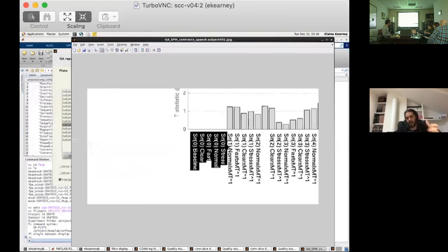And that's why it's telling you that the individual effect sizes are not estimable, but the contrasts that you are then looking at are estimable, because you're always going to be comparing, for example, stress minus baseline or normal minus baseline. So those contrasts are the ones that are shown in the right plot. Those are estimable, even though the individual effects are not uniquely estimable, because you could just add 2 to the numbers that you get for the beta values.